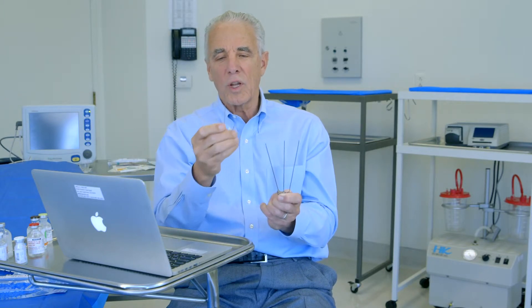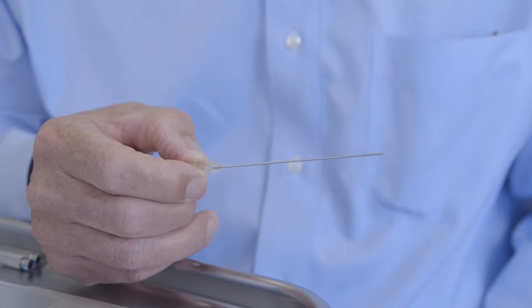A typical pattern for infiltration is to do a little bit of infiltration using a spinal needle — this is a 20 gauge spinal needle. We will initiate the tumescent infiltration with a 20 gauge spinal needle, just a little bit under the skin, in the superficial fat and mid-level fat, just enough to subsequently allow these blunt-tipped cannulas to be placed with minimal discomfort. We don't use very much volume with this, but just enough to make the rest of the infiltration comfortable.